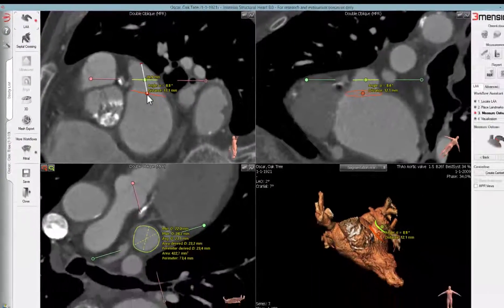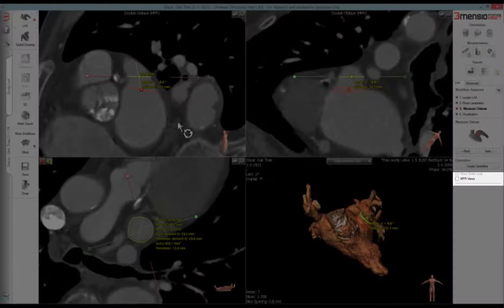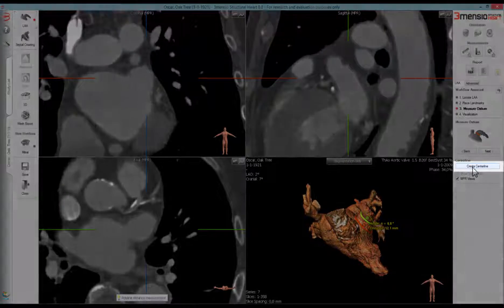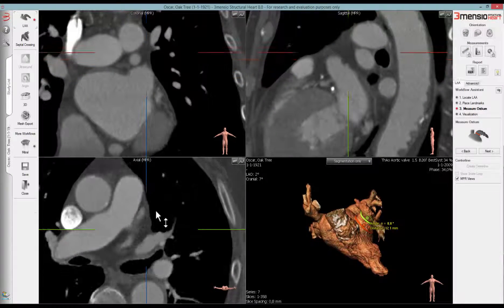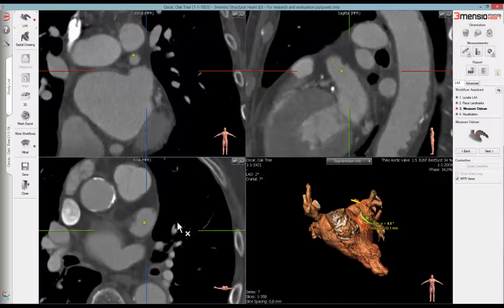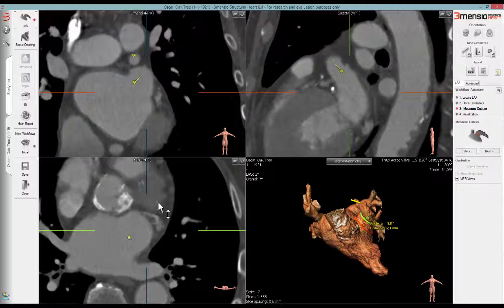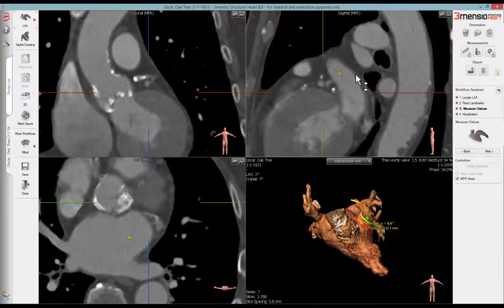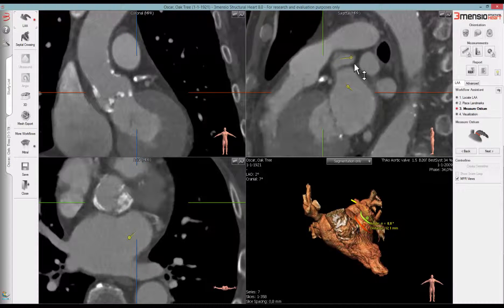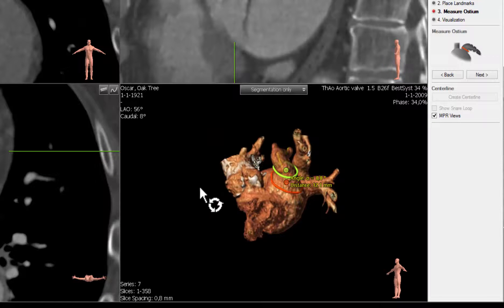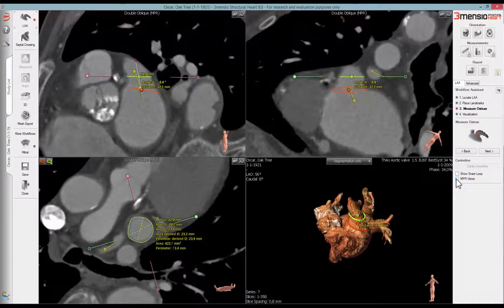To assess the orientation of the LAA, we can place a centerline going through the LAA. Click on the NPR viewport on the right to obtain an axial, sagittal, and coronal view. Click on centerline to start placing it, then place the centerline from the tip of the LAA to the ostium. Double left click to finalize the centerline. Once placed, control points can be edited in all views. To exit the NPR view, uncheck the box on the right, then click Next.